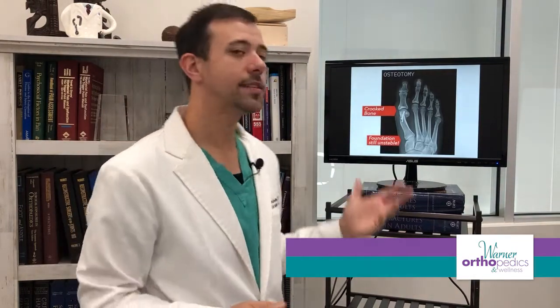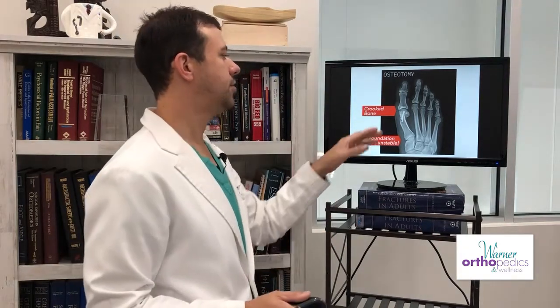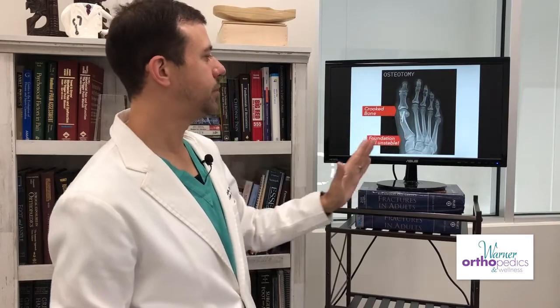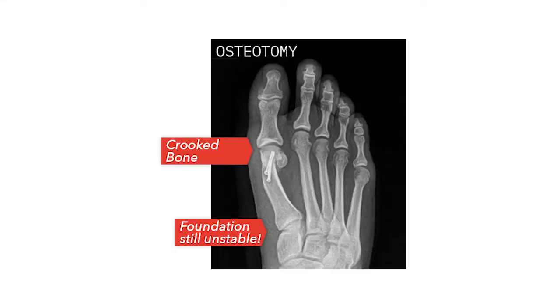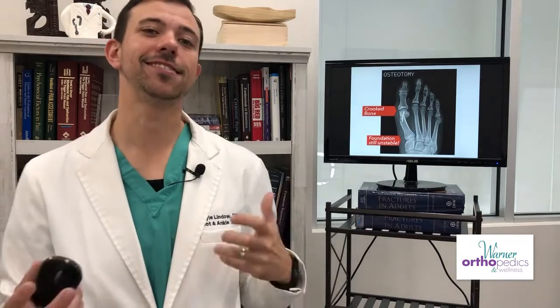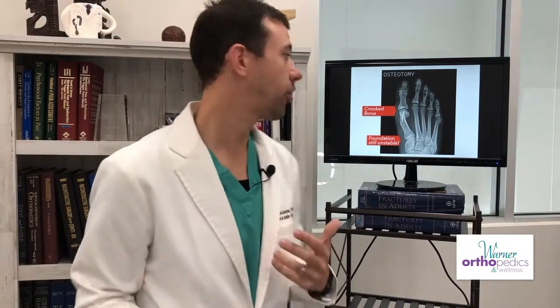So this is a postoperative X-ray of an Austin bunionectomy, and as you can see here, the first metatarsal head has been shifted over, and it's fixated. The problem with this is you're creating abnormal anatomy again. Now you have a crooked bone and the foundation is still unstable. That results in a much higher chance of recurrence.